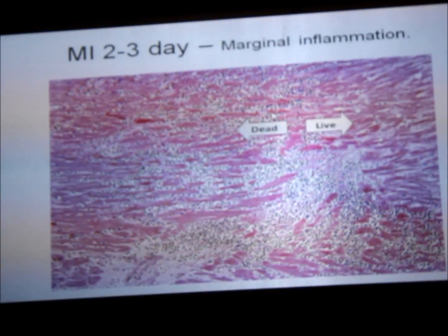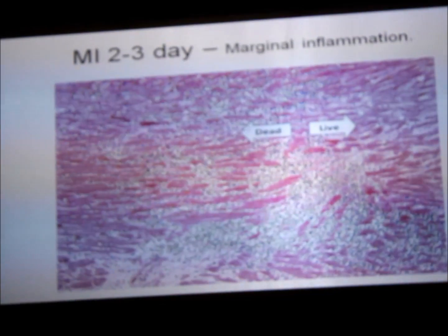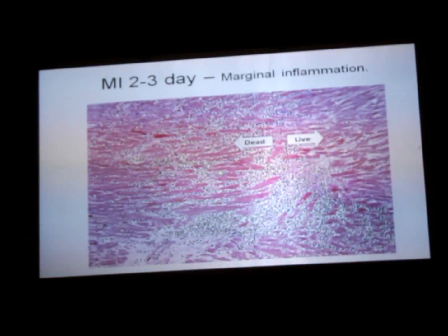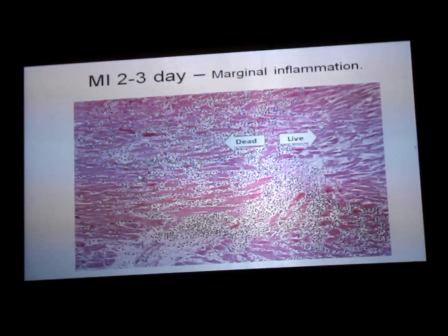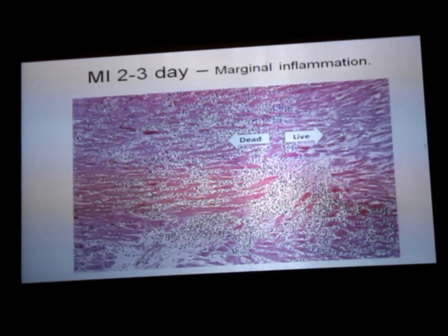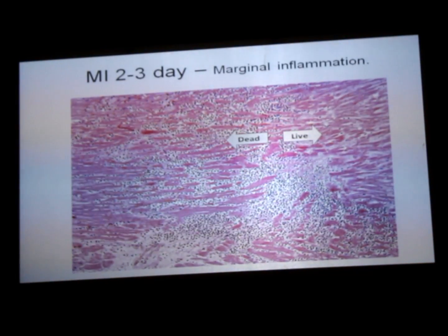This side, whatever tissue is present, the whole thing, this is the area where there was compromise in blood supply. Okay, so all these are dead cells. Now in necrosis, as you have studied in morphology, the cells appear more eosinophilic, more pinkish in appearance, because the cytoplasm takes up more stain. They become more pink in appearance compared to the normal tissues. Okay.